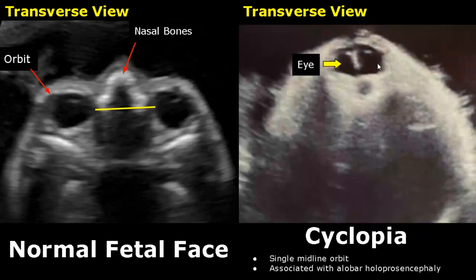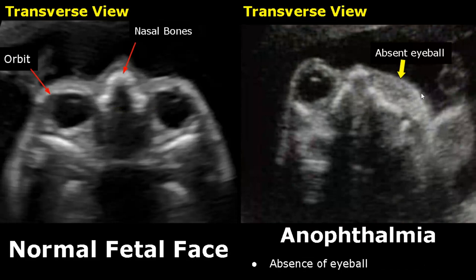Cyclopia occurs in a severe case of holoprosencephaly. In cyclopia, there is only a single midline orbit which contains either one or both eyes — we can only see a single orbit in the midline. Anophthalmia refers to absence of the eyeball; in this transverse view, we can only see one eyeball.